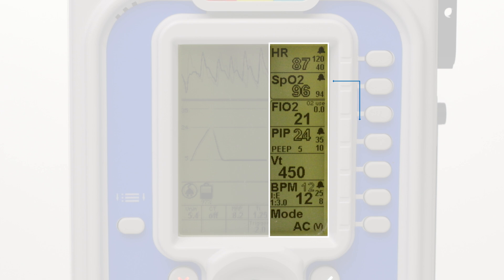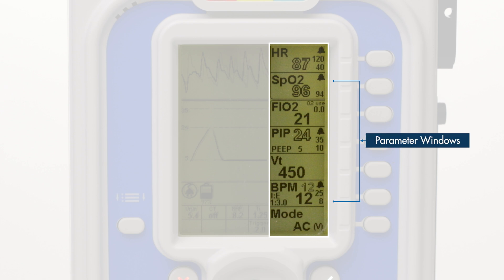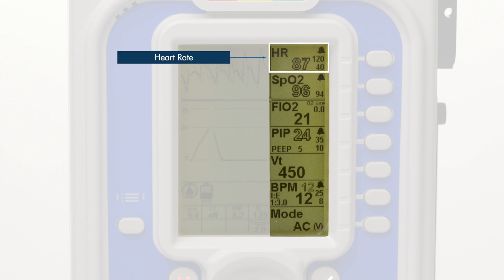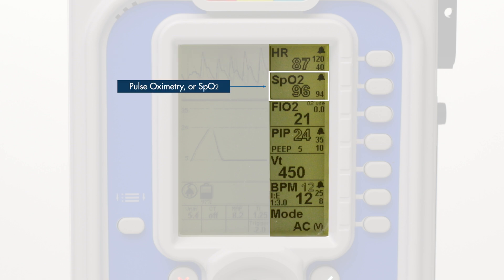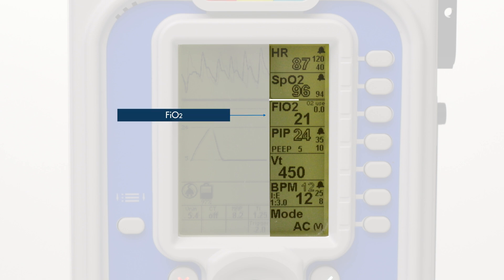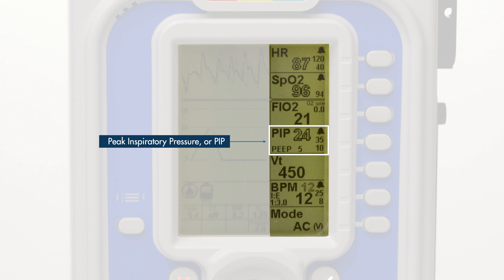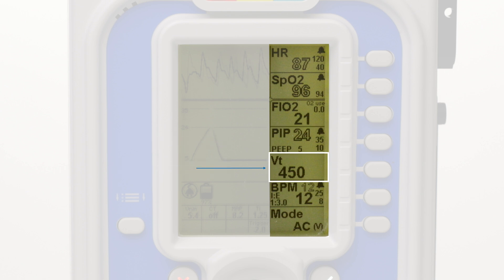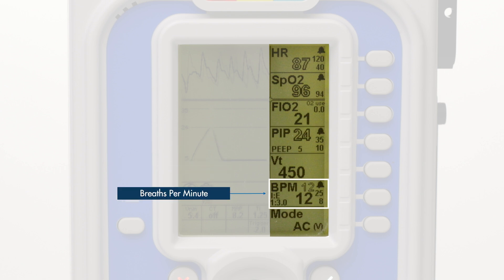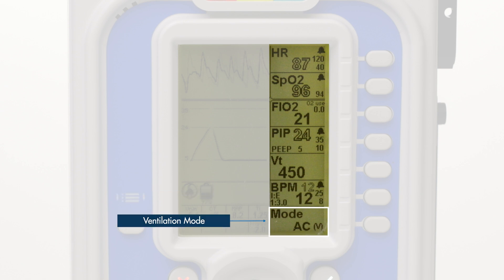Along the right side of the screen are the parameter windows. There are seven parameter windows in total: heart rate, pulse oximetry or SPO2, FIO2, peak inspiratory pressure or PIP, tidal volume, breaths per minute or BPM, and ventilation mode.